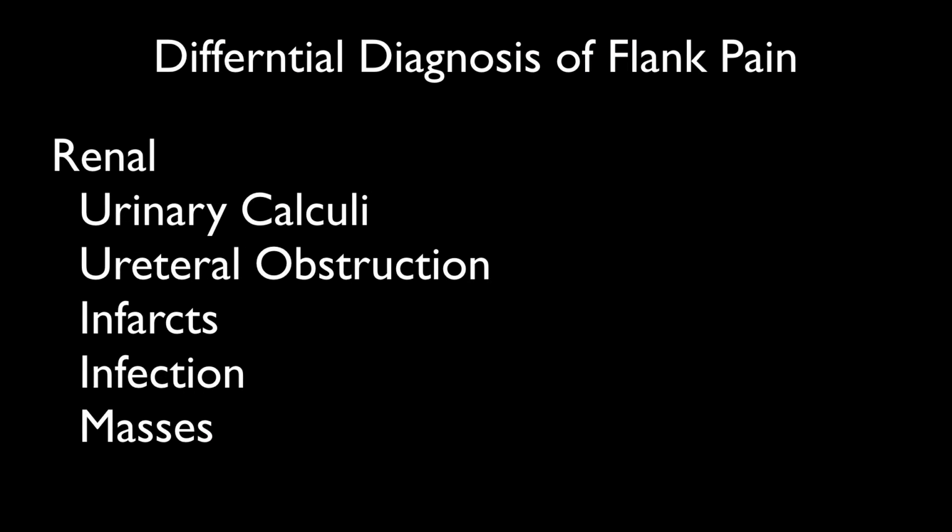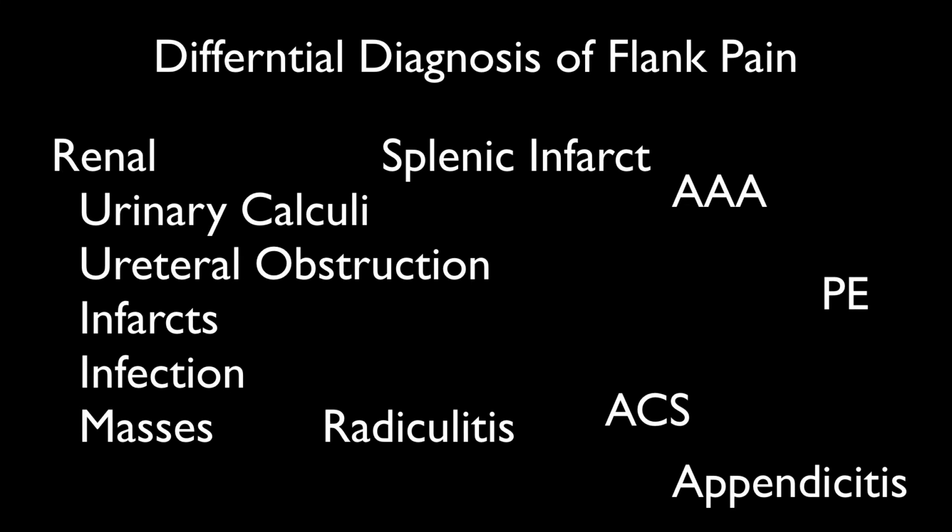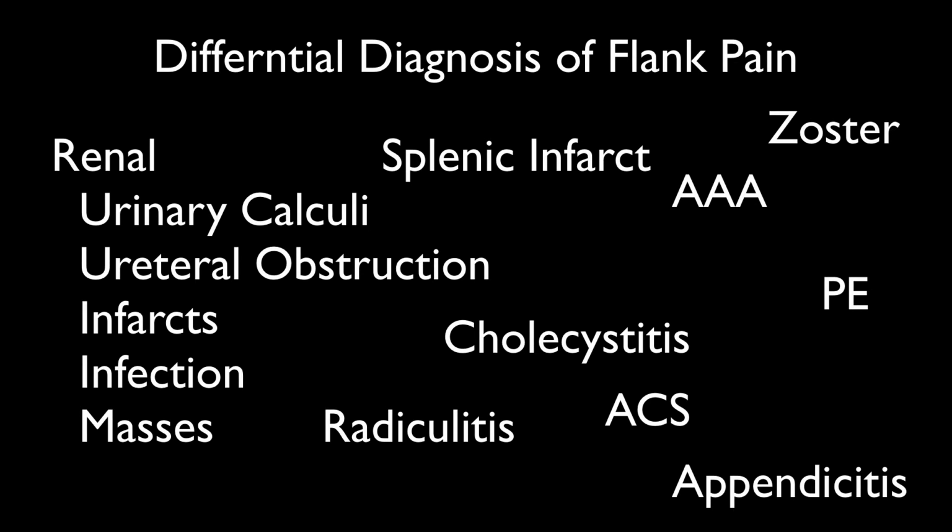But in the emergency department and perhaps the primary care setting, what we want from point-of-care ultrasound is a goal-directed question, which is how can we narrow the differential diagnosis of something like flank pain or abdominal pain? The differential diagnosis for flank pain is broad, but using point-of-care ultrasound to look at the kidney for hydronephrosis, and then if indicated, looking for a AAA, and then cholecystitis can rapidly narrow our focus.